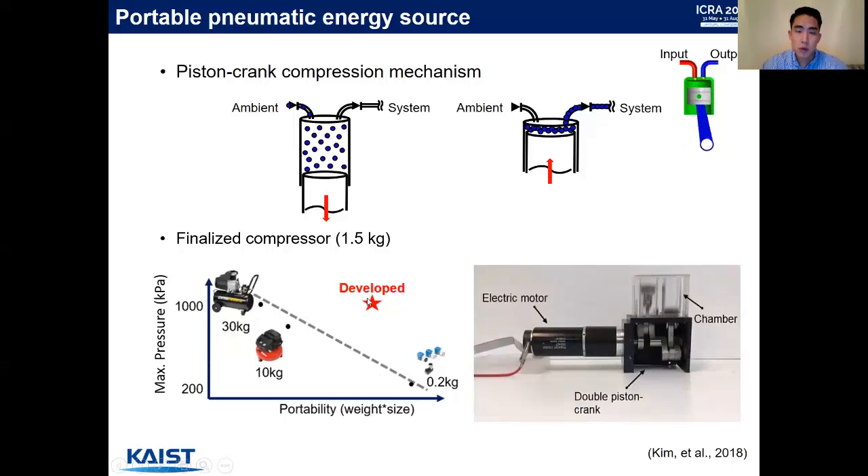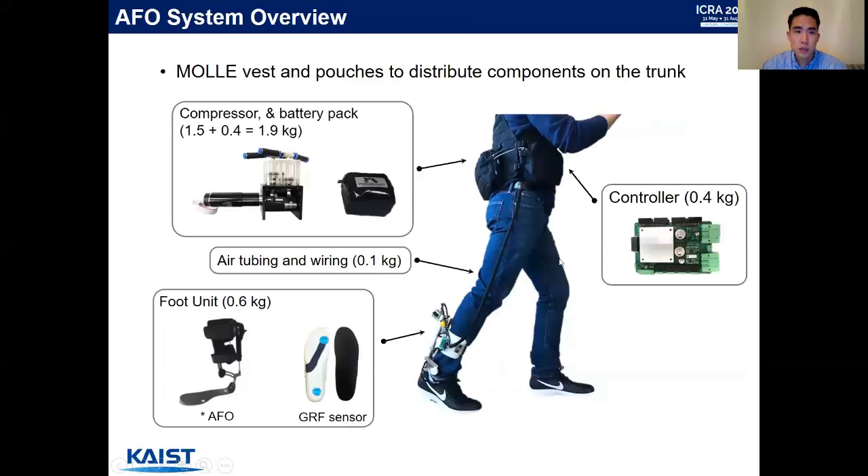We use this developed system to build an AFO system. We use molded vests and pouches to distribute the components over the trunk. The compressor and battery pack, which is 1.9 kilograms, is attached to the back of the trunk and the controller in front. We then use air tubing and electrical wiring to connect the trunk unit to the foot unit. The foot unit weighs 0.6 kilograms, including the AFO and GRF sensors, which are used to detect different gait cycles.